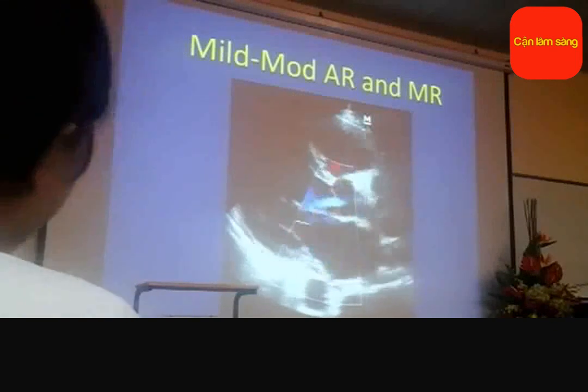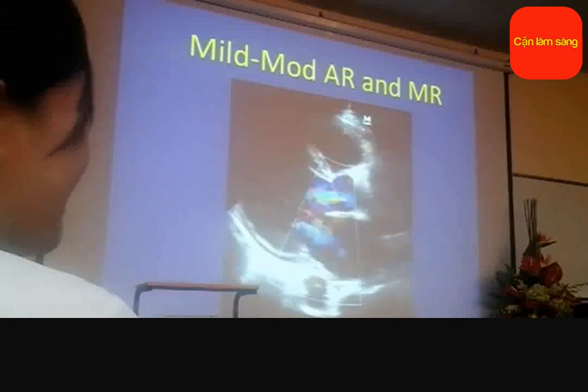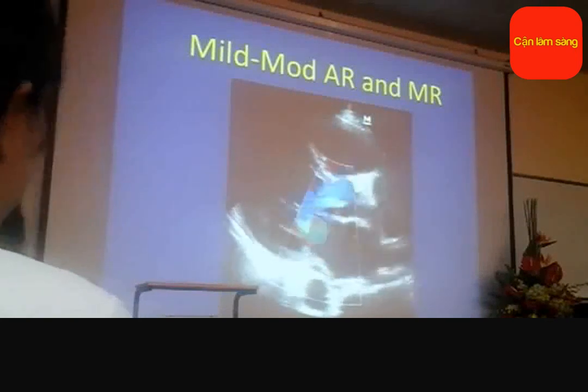And this patient of course has both some mitral regurgitation and some aortic regurgitation.